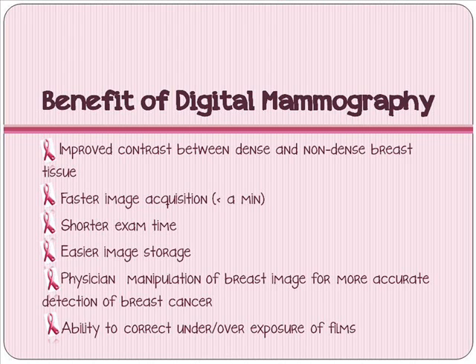It also gives faster image acquisition, which is less than a minute, because there is no film to develop. In addition, digital mammography will give a shorter examination time. Thus, this will improve patient comfort. And usually the time needed for the examination using digital mammography is half the time of film-based mammography.